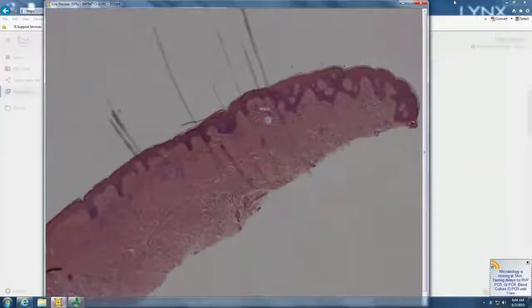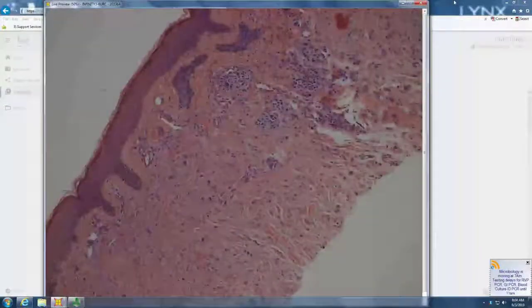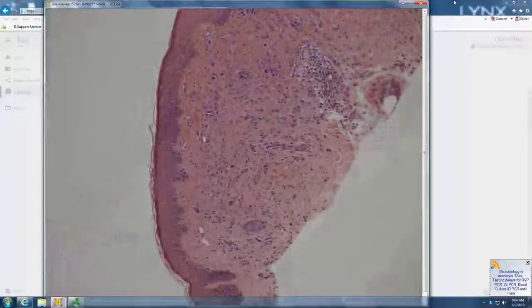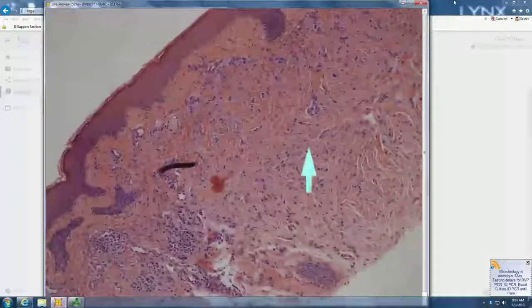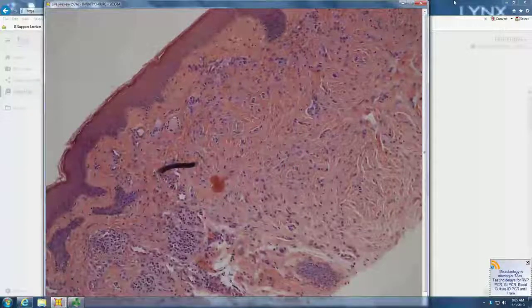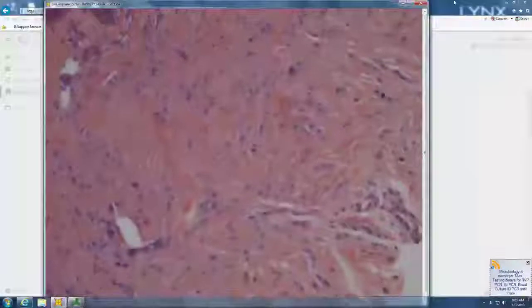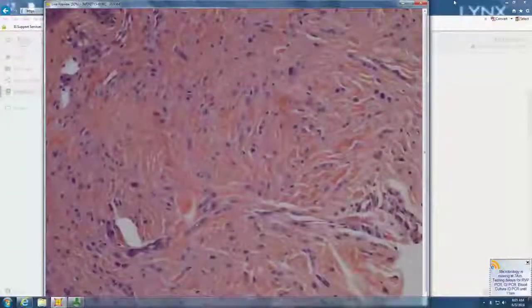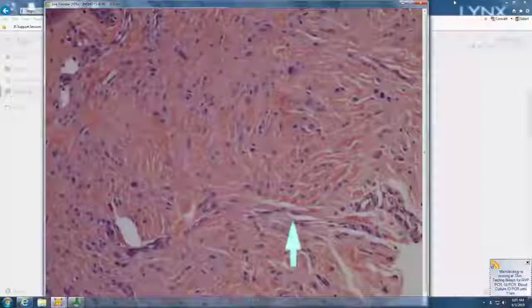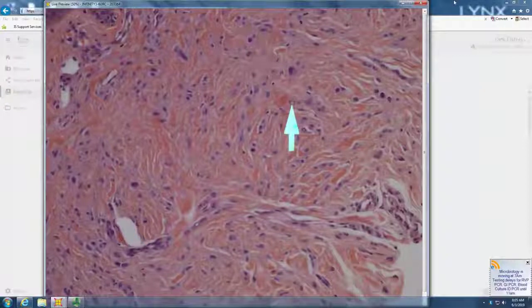Okay, so looks like a dermal infiltrate. And your collagen is normal, or your collagen is not normal? It looks hypercellular. Yeah, so the collagen's a little bit dense and ropey, right? And then what kind of cells? Nuclear pseudo-inclusions suggest what?